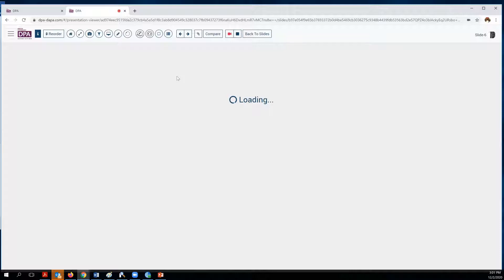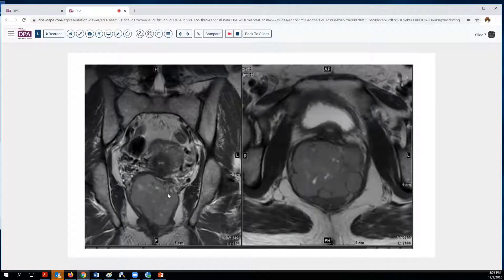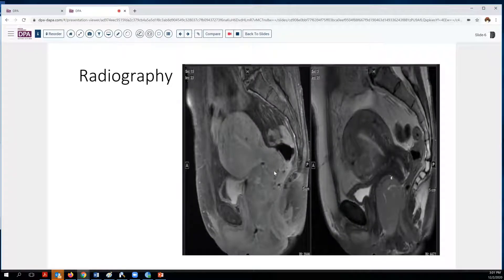The lesion was quite bulky, about 8 to 10 centimeters. We can see here the lesion sort of compresses anteriorly into the bladder and is compressing here as well. In the sagittal view, we have an enlarged uterus with probably some myomatous changes. Then we have this lesion here that is sort of hanging off of the rectum and extending anteriorly, compressing and closing off the vagina.